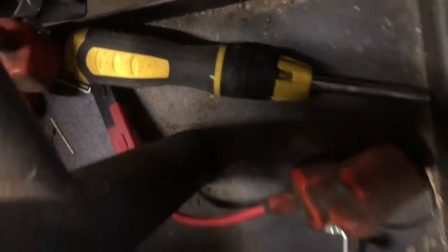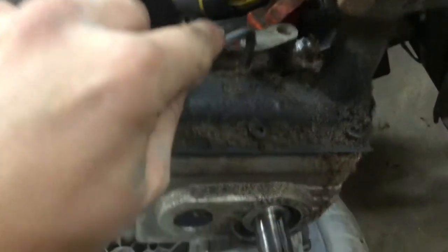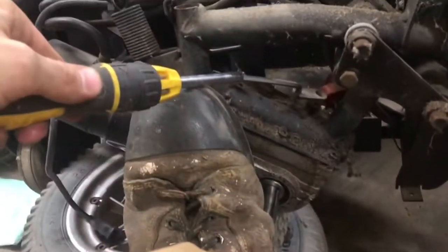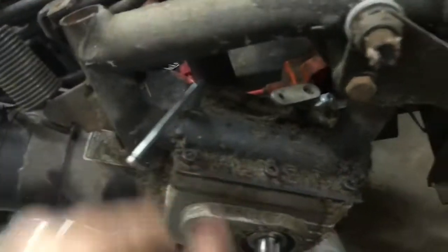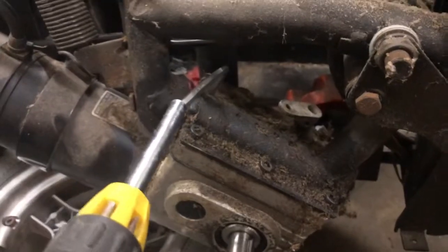Okay. So that was the hardest one. I would take that one off first when we get to it. You just want to just barely loosen them. We won't try that again. Hopefully you just have to do that one time. All right, my tool's a little too long. There we go. And this will be the last one I haven't gotten yet. Okay. There we go.